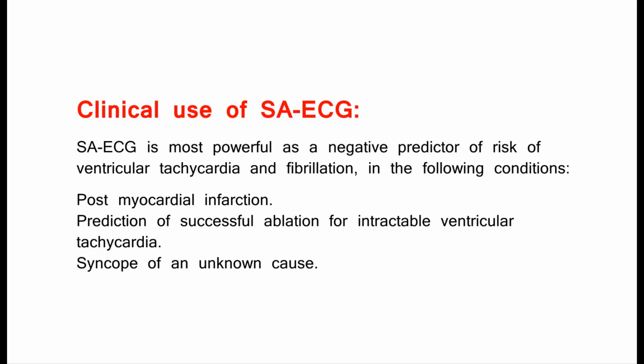Clinical use of SAECG. SAECG is most powerful as a negative predictor of risk of ventricular tachycardia and fibrillation, in the following conditions. Post-myocardial infarction. Prediction of successful ablation for intractable ventricular tachycardia. Syncope of an unknown cause.